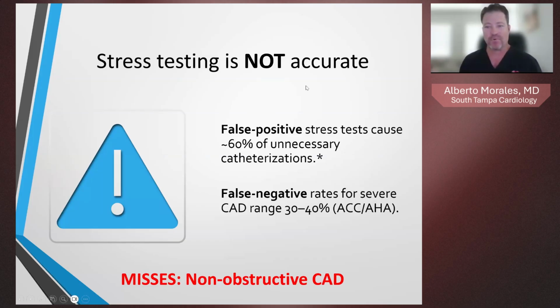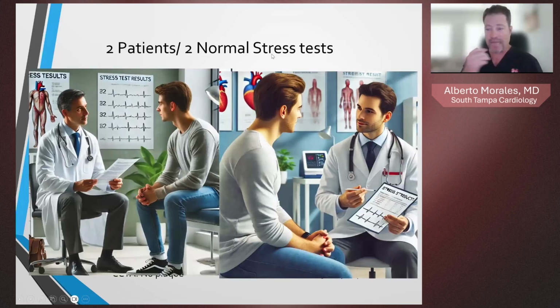And you might ask, why is that important? So here's a typical day in a cardiology practice, and you're seeing two patients. Both of these patients have normal stress tests. And here's the cardiologist going over the stress test, congratulating them, telling them, your stress test is normal, you're low risk, this is good data.